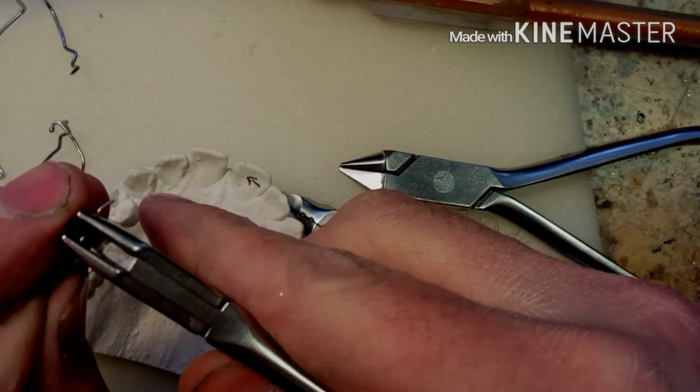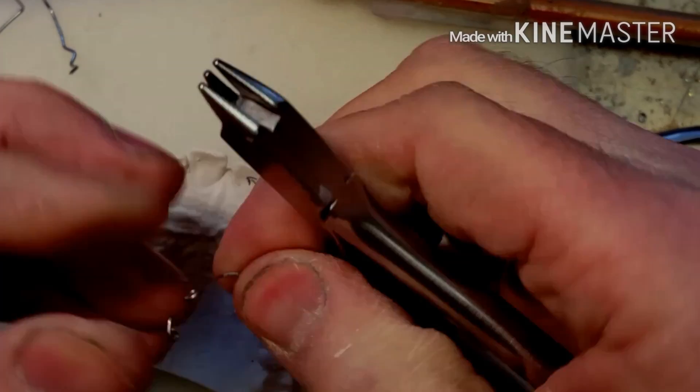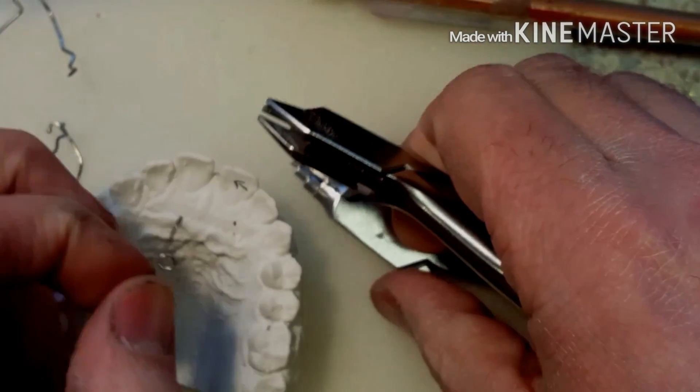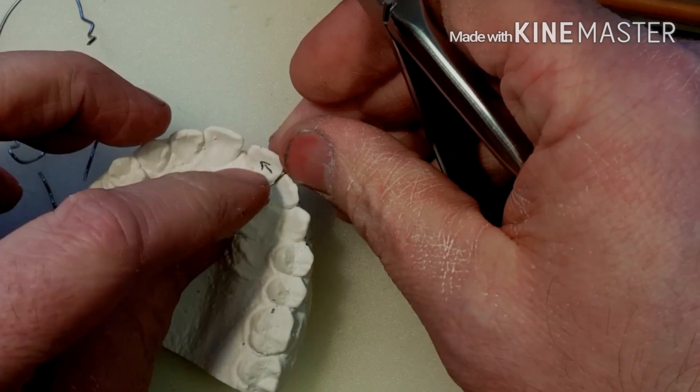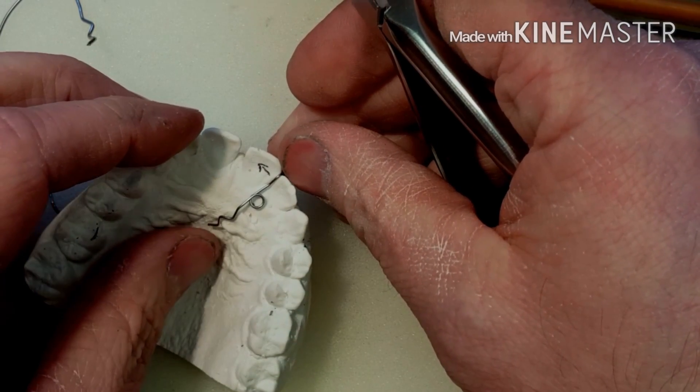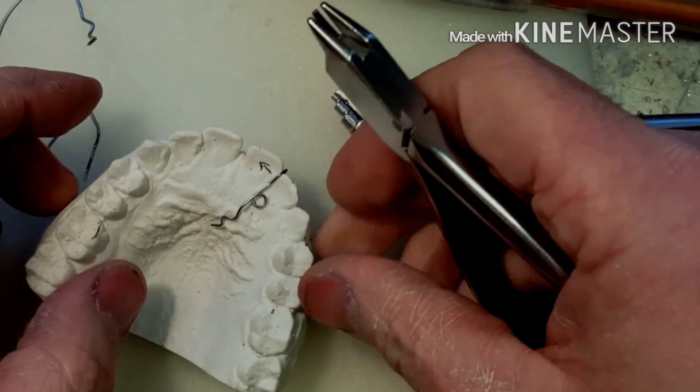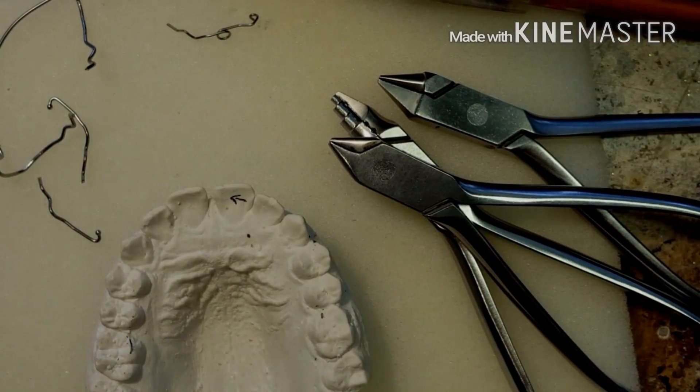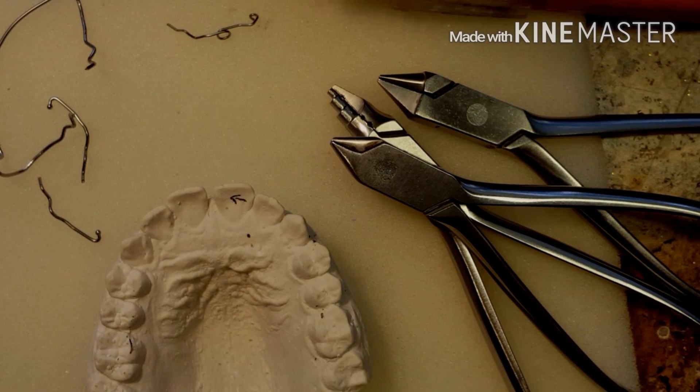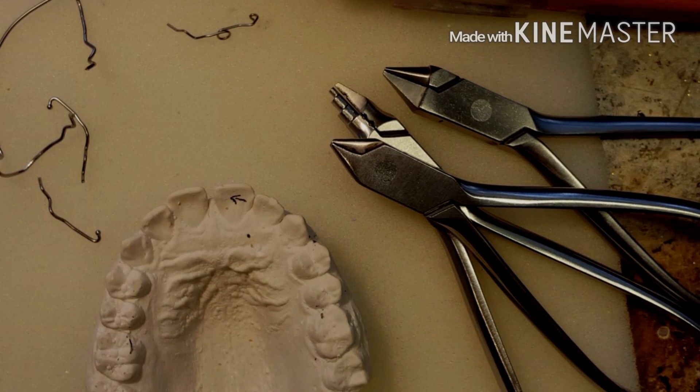You're going to lay the spring on the model, but the trick is that it has to allow space underneath for the acrylic. Now what I did in this video is I sped up the patient's right side because I didn't want to bore you to tears, so I'm going to speed it up.